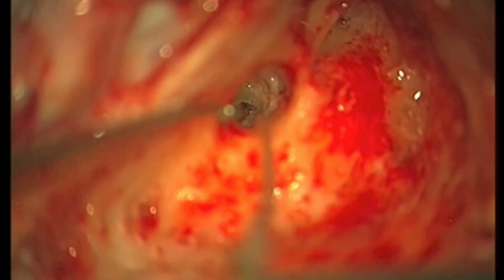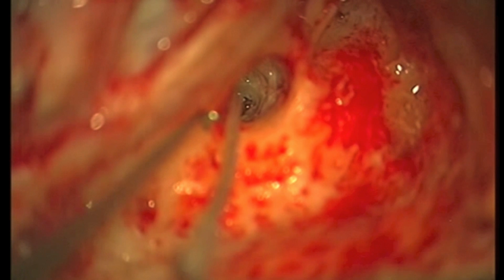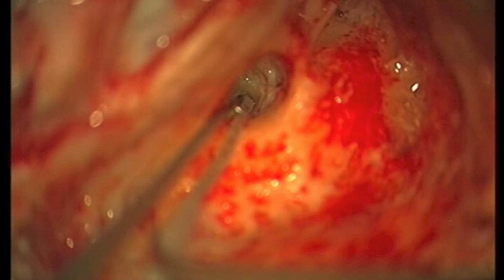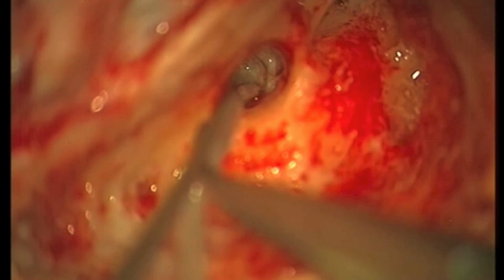So this is the fluid that's within the inner ear, just a little bit of it coming out. And you can see the electrode just very gently being passed through that hole, and it just curls around the cochlear. It's like a snail shell. Okay, next slide, please.